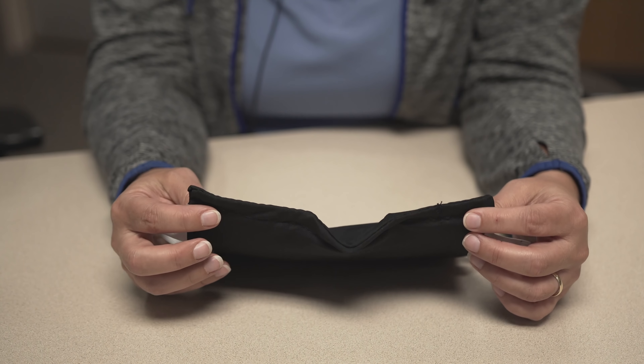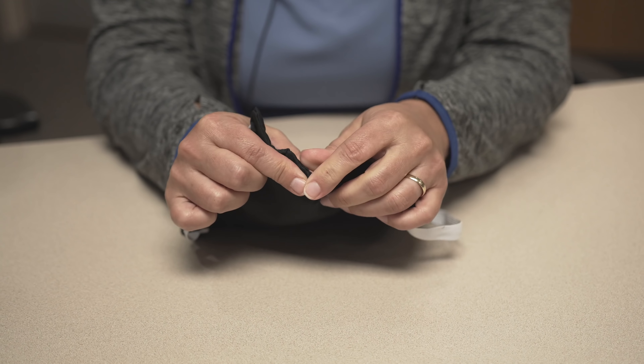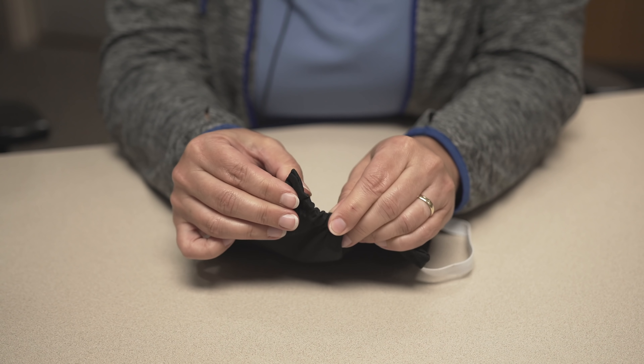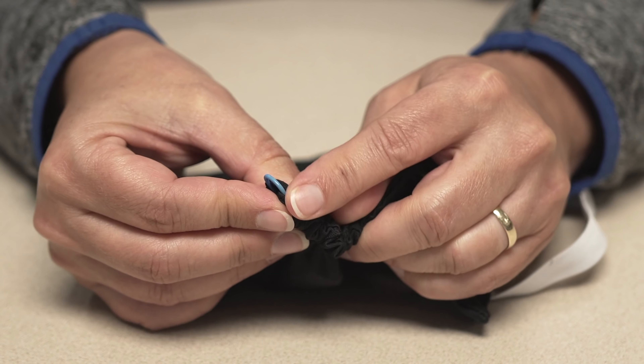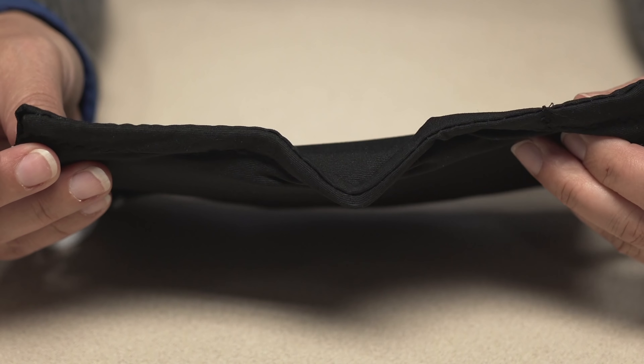At the very top of the mask, there's a pocket that the nose piece can slide in and out of if it needs to be replaced. You can see the nose piece can be taken in and out and positioned correctly.